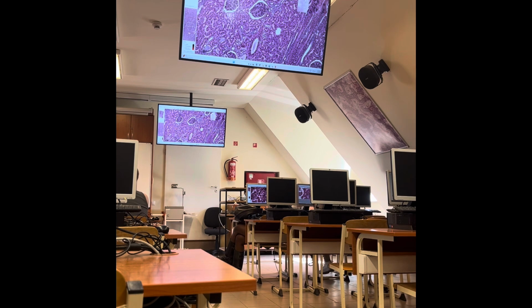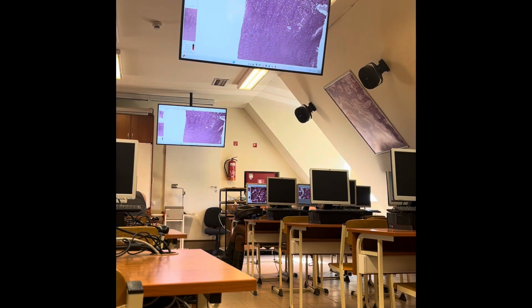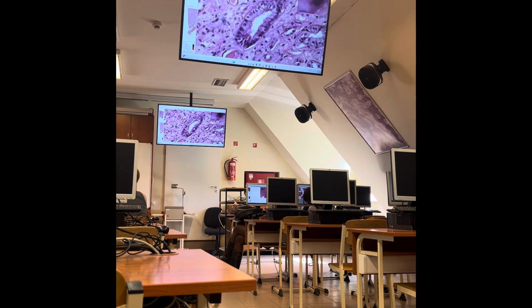Yes? I would like to know, is it true that it goes from low cuboidal to low columnar? Yes, so in the cortical segment, they have single cuboidal epithelial lining, but as we travel into the medulla, to their terminal portion in the papilla of the pyramid, then they turn into columnar cells. So there is a very gradual change of the lining epithelium, and finally the terminal portions will be like columnar epithelium.